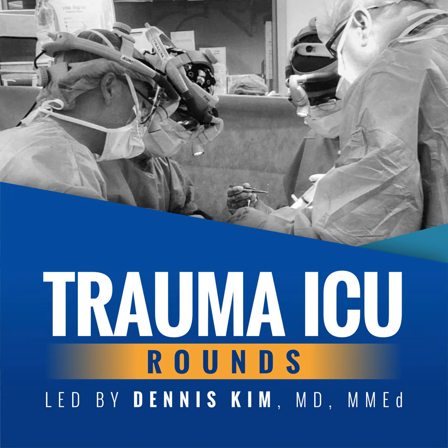But in order to answer the first question, can my patient breathe on their own without the ventilator, we need to perform two key assessments. First, we need to assess our patient's readiness for an SBT, and we'll talk about how we make that determination in just a minute. Second, once placed on the SBT, we need to assess if our patient is tolerating the SBT, and we'll talk about some of the measurements that we use to do this when we discuss Objective 2 of today's rounds. In terms of answering the second big question, can my patient breathe without the tube, we'll get into this when we tackle Objective 4, and so let's now focus, at least for the time being, on readiness assessment.